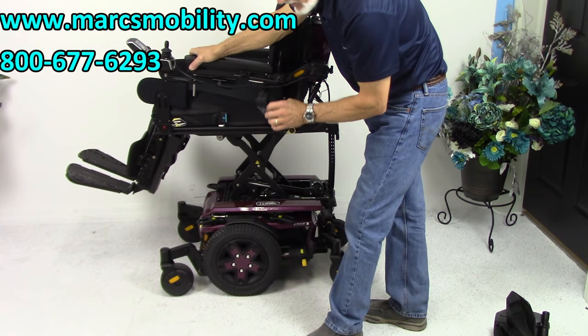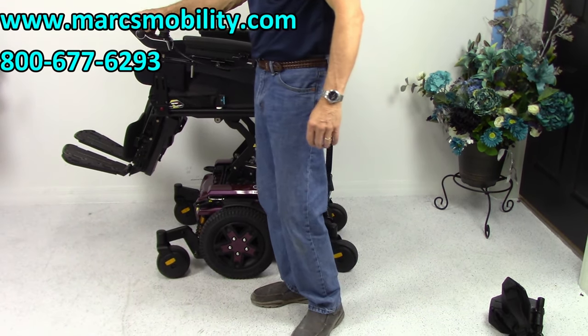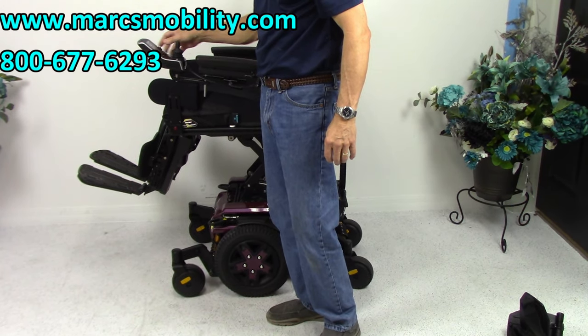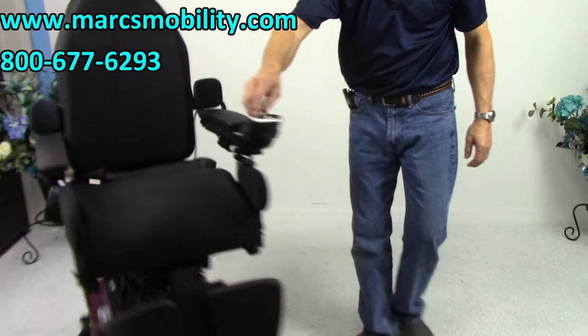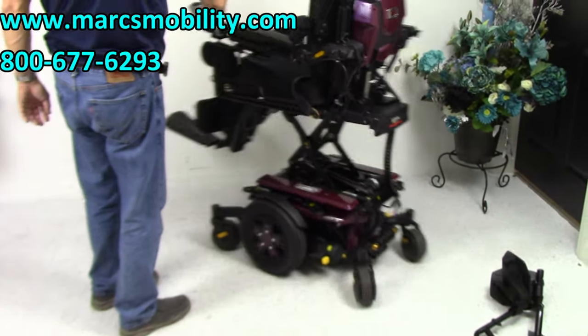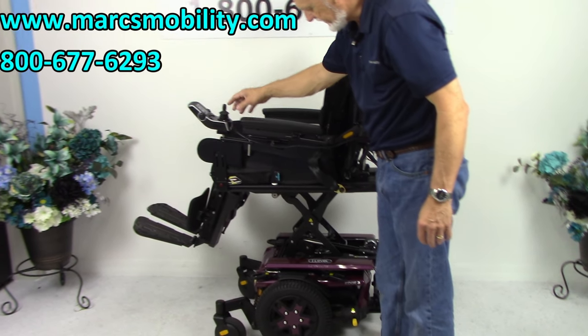This is the only company where this chair will drive at three miles an hour while the seat is elevated. I'm not going to be able to show you that in here, but you can see it moves around pretty good. You can still drive this chair with the seat elevated.